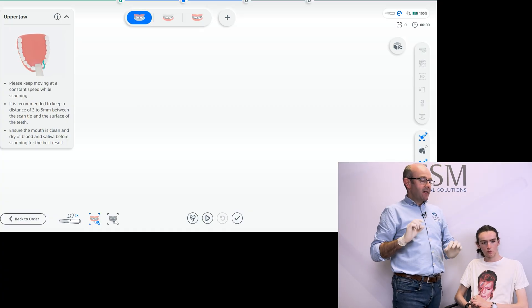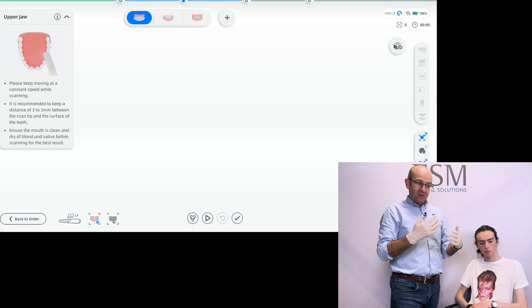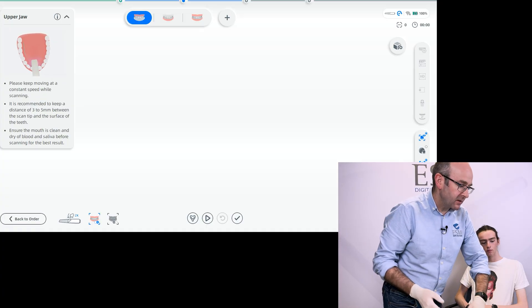If we do get things mixed up, there is a swap scan button within the software. So if at some point you've scanned the lower when you should have scanned the upper, it's okay — we can click on the swap scan button.